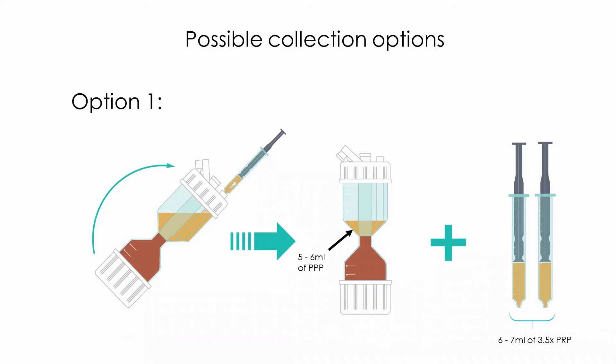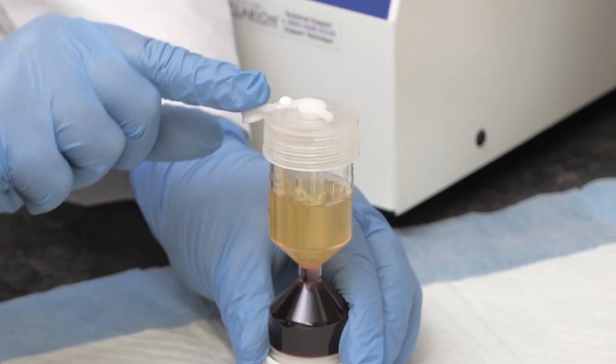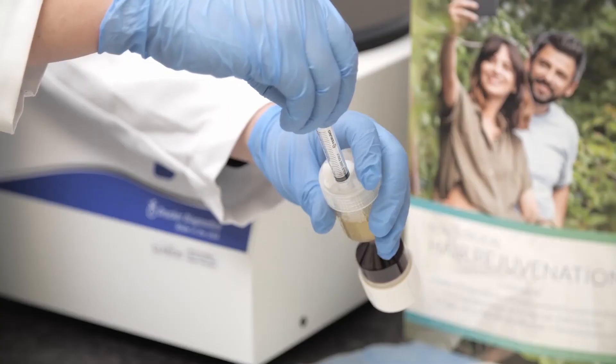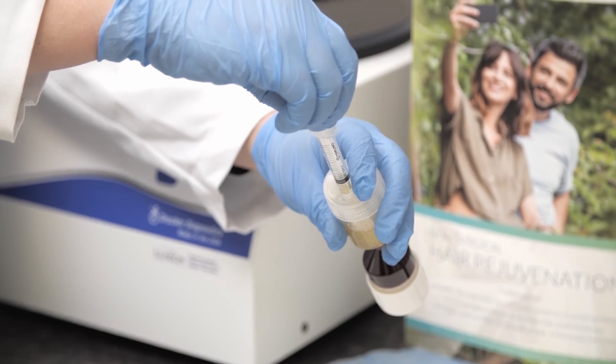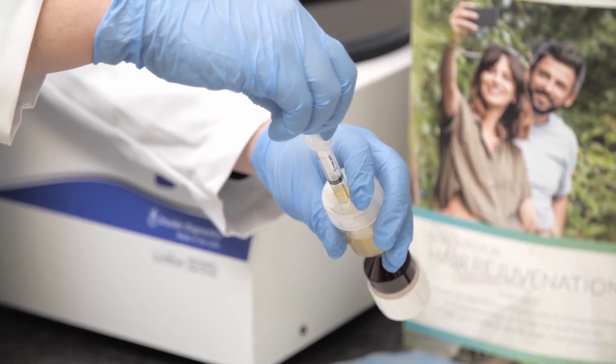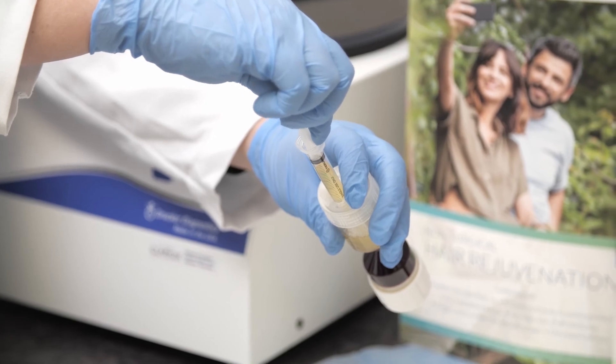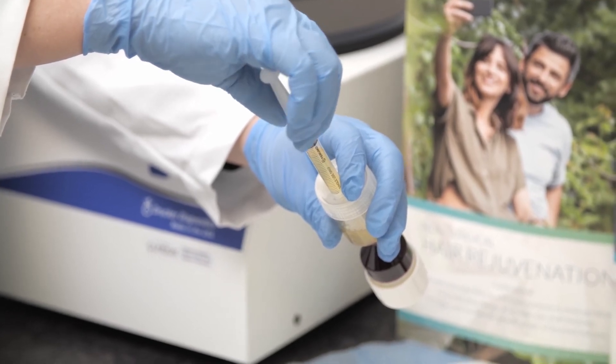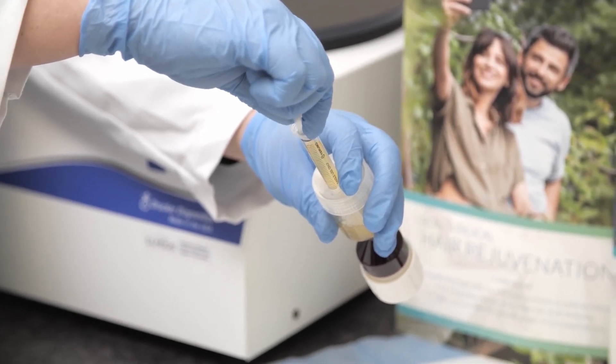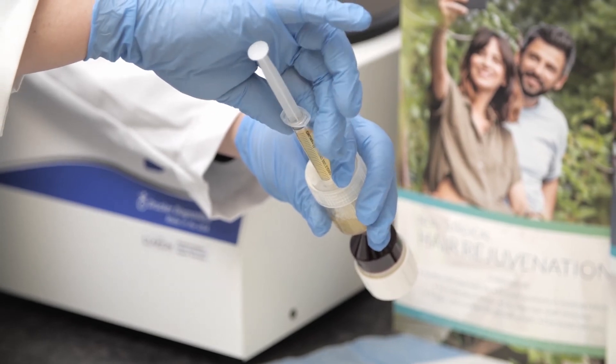Possible collection options. Option one for a 3.5 times concentration with roughly 6 to 7 mls of PRP: immediately after sealing the red blood cells in the bottom chamber tilt the hourglass towards you at a 45 degree angle with the outer port at six o'clock position and aspirate half the contents. The aspirated contents are the platelet rich plasma and buffy coat. This will leave the platelet poor plasma in the hourglass.